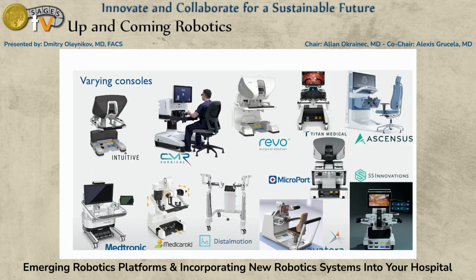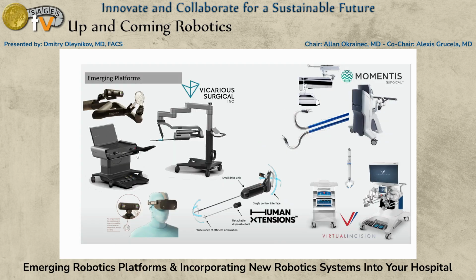We talked about the robot, but how do you control the robot? There are a number of consoles out there. We saw the image from a 3D console. You have to have goggles for that if it's an open console. Then there's a console where you have an immersion, where each eye represents a slightly different view to give you a three-dimensional representation. And some consoles are open, some consoles are really almost like you're standing next to them. It's amazing, the variety, but they all try to accomplish the same thing.